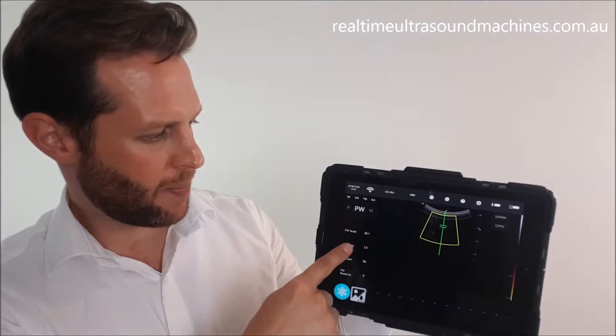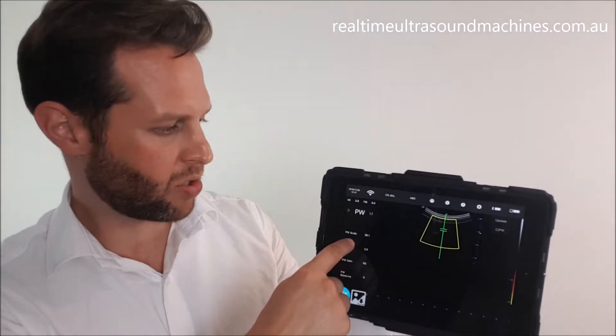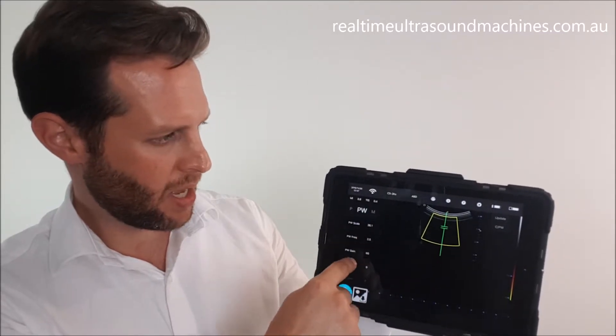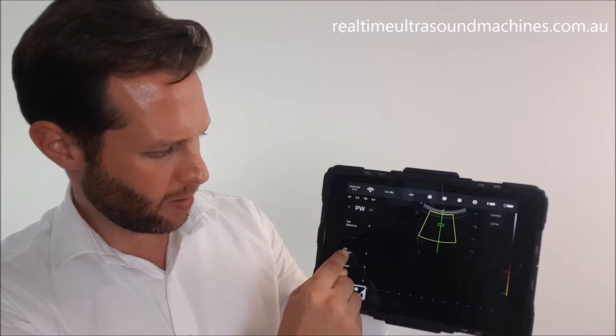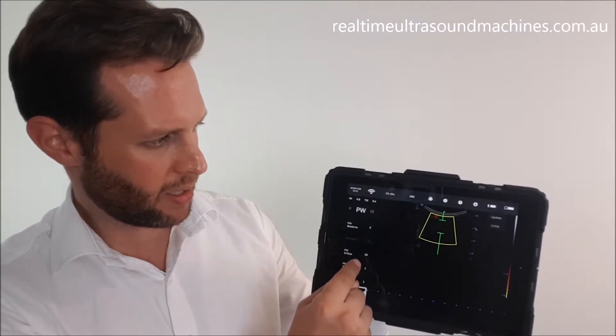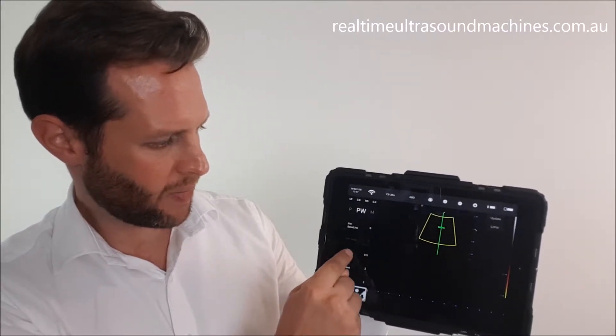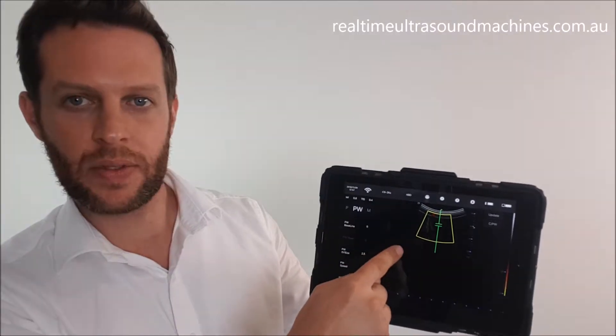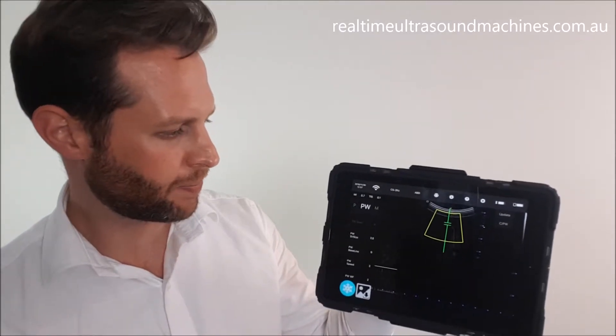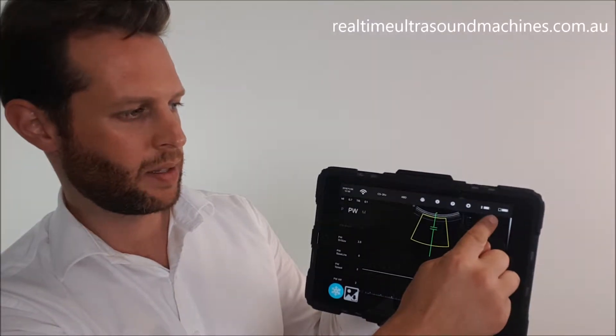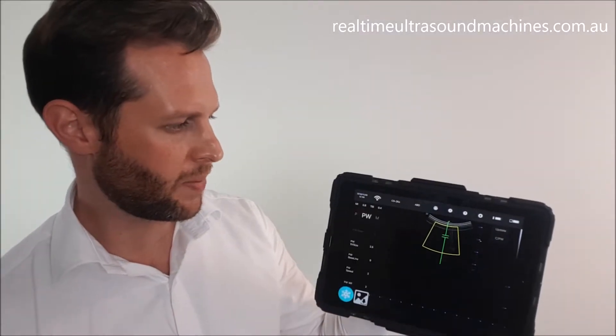Similar to the B menu, you've got all your Doppler optimizations here. For example, if you want to change the size of the sampling gate, you can do that by sliding across with your fingers. Once you're happy with the position of the sampling gate, just hit update and it'll start to sample the Pulse Wave data. When you're finished, hit update again to exit the mode.